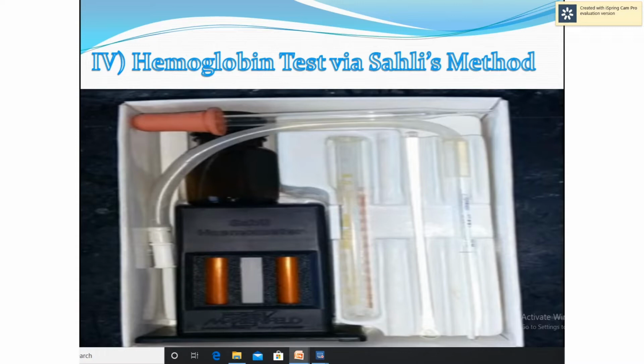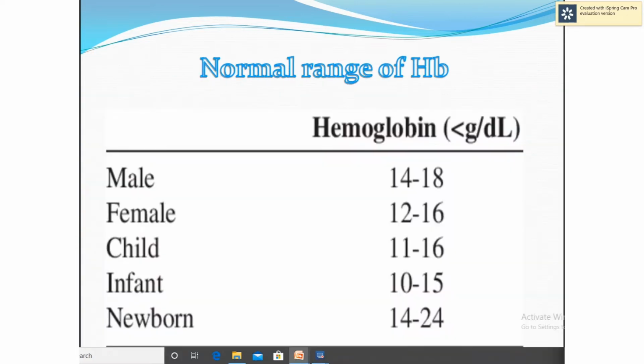Hemoglobin levels are measured by a blood test. Hemoglobin, or Hb, which is the short form, capital H small b, is usually expressed in grams per deciliter of blood. A low level of hemoglobin in the blood relates directly to a low level of oxygen. Before knowing the risk factors for high and low hemoglobin levels, let us first know how this particular experiment is performed.